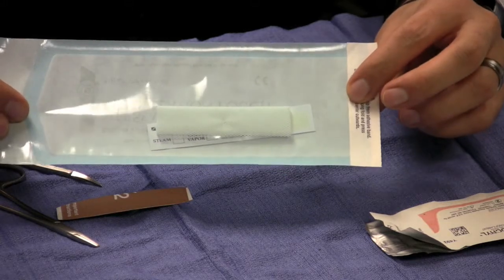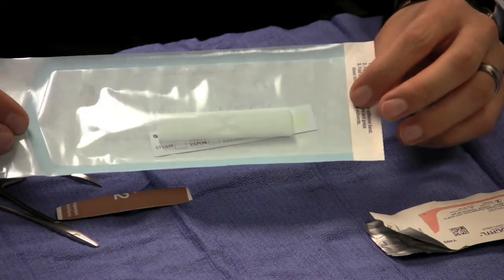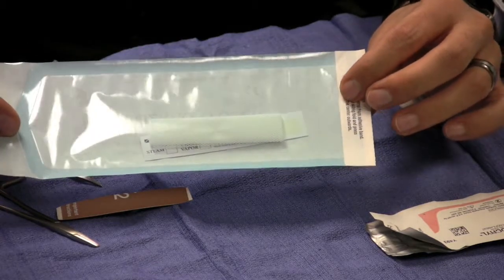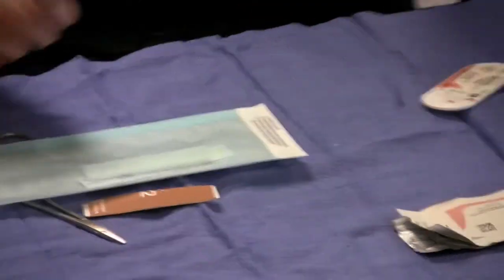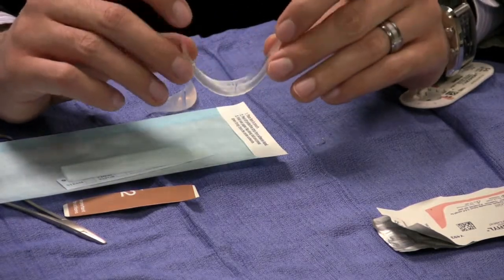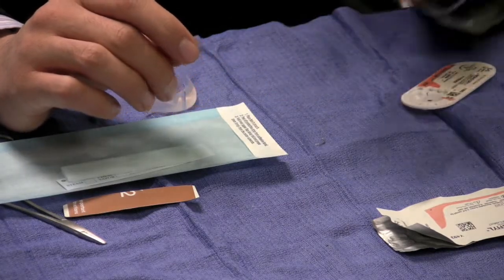On top of that, I always have patients on oral antibiotics for about a week to 10 days to reduce the risk of infection, and make sure that you have good oral hygiene, not to get any dental infections, because usually infections to the chin come from a dental source. So that's a Mersilene mesh chin implant, and it's an alternative to the pre-made silicone or Medpor implants that you see here. Again, I think that Mersilene mesh is softer, more natural, does not shift, and conforms to your chin better. Thank you.